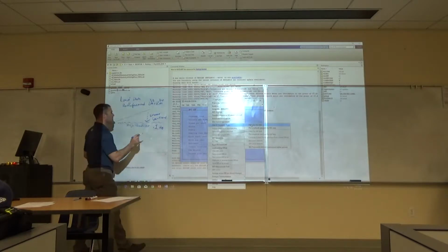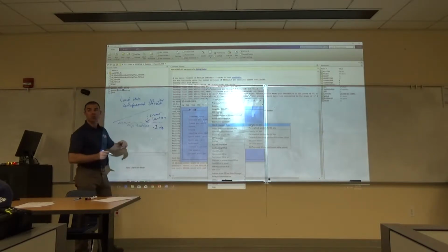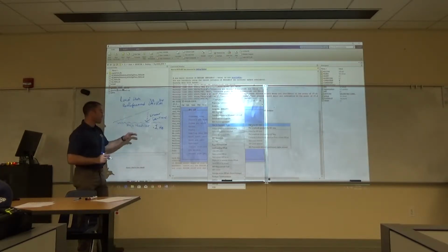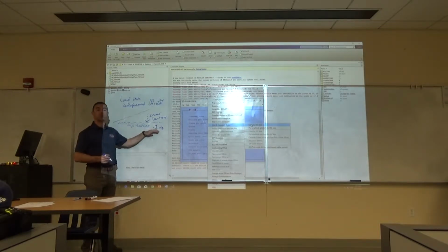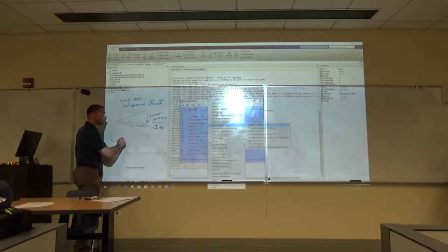So we're going to detrend it so that it's kind of flat. Do you guys remember the logic behind that? It is a threshold and a cutoff point. We're going to say everything higher than 0.1 hertz is allowed to pass through, and everything lower than 0.1 hertz, in terms of an oscillation, we're going to filter out.